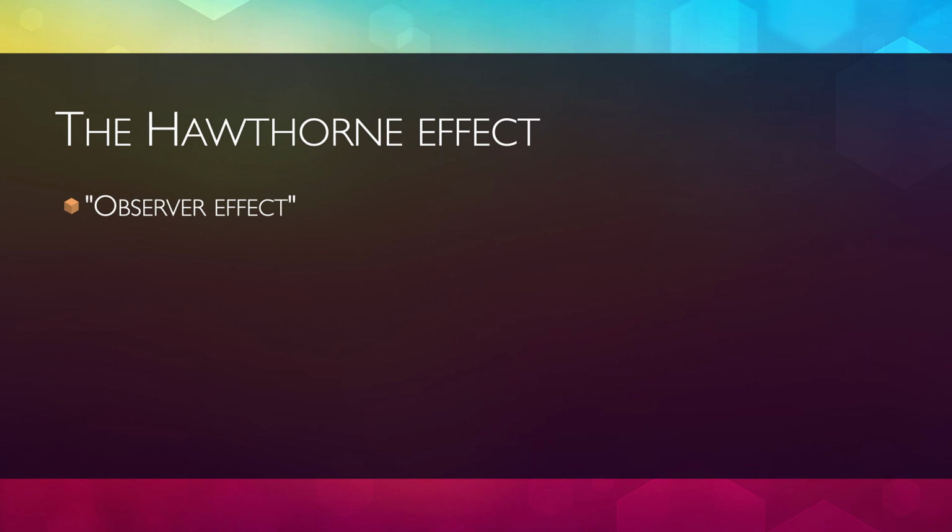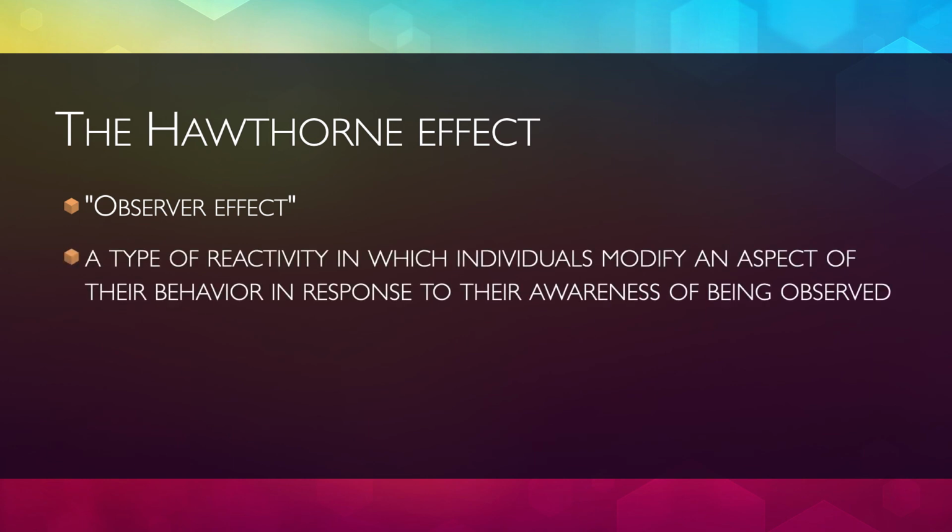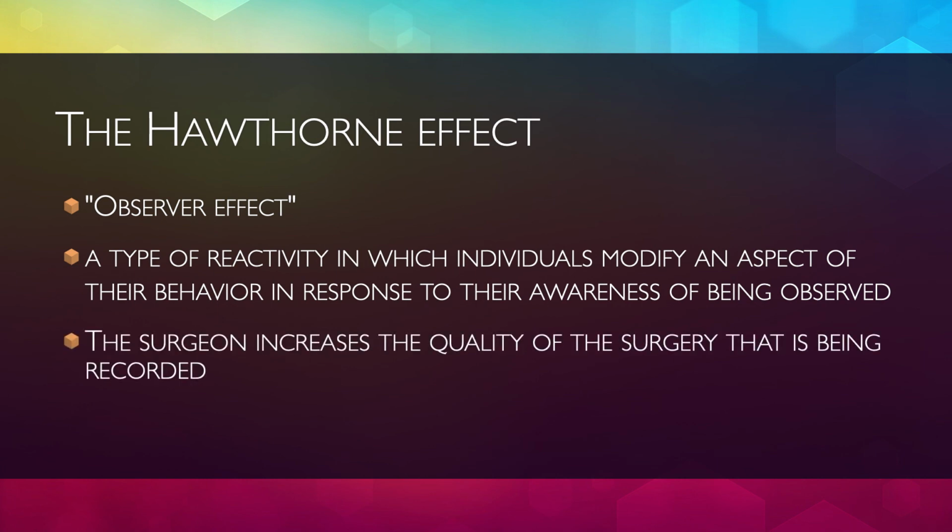Recording surgeries almost always ends up having a very positive effect on the surgeon's technique, in a kind of Hawthorne effect. The surgeon increases the quality of the surgery that is being recorded and ends up incorporating improvements on his technique elicited by that.